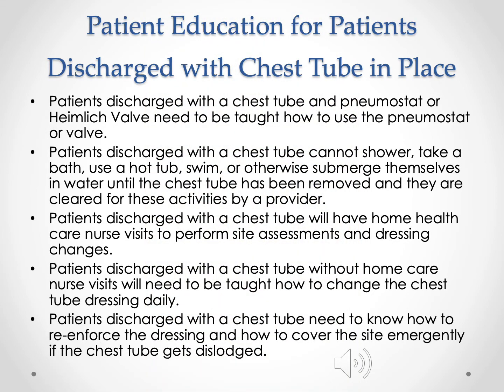Patient education for patients discharged with a chest tube in place. Patients discharged with a chest tube and pneumostat or a Heimlich valve need to be taught how to use the pneumostat or valve. Patients discharged with a chest tube cannot shower, take a bath, use a hot tub, swim, or otherwise submerge themselves in water until the chest tube has been removed and they are cleared for these activities by their provider.